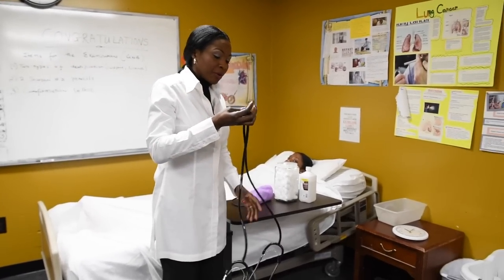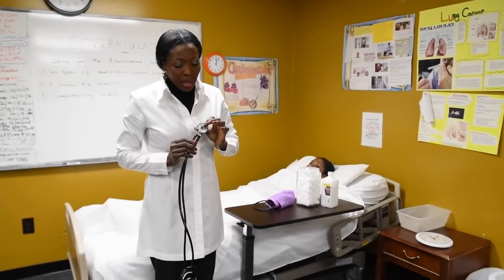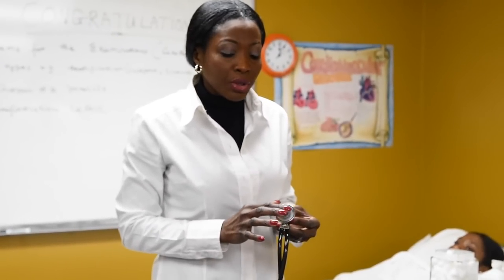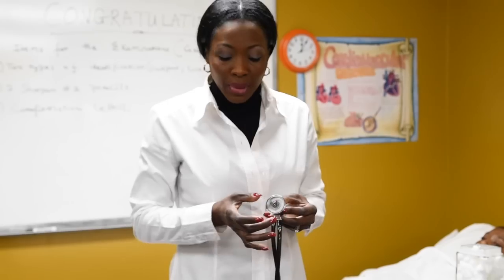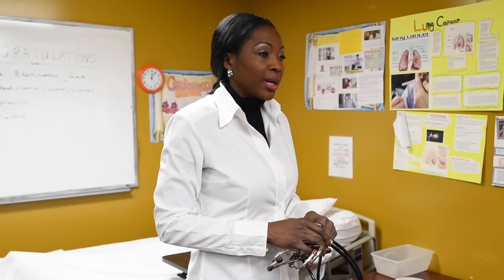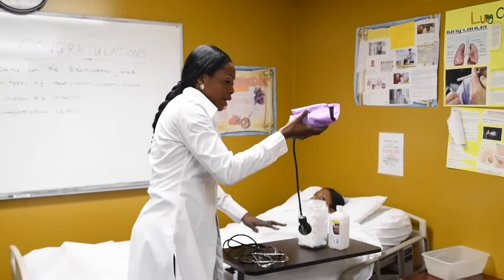But before I go any further, although I know your instructors taught you this, when you take a stethoscope, we said this is the diaphragm, this is the part that you're going to be placing on the brachial artery, okay? So you're going to disinfect the diaphragm, and you would also disinfect the two ear pieces. It's not the examiner's responsibility to disinfect the ear pieces. You would disinfect them, hand one to her and keep one as well, okay?